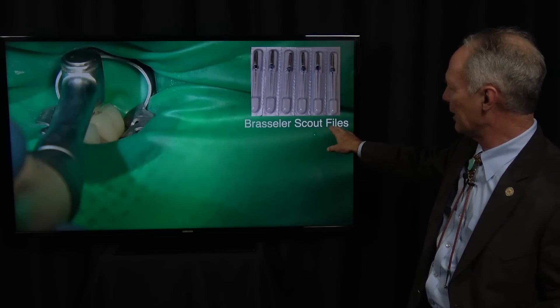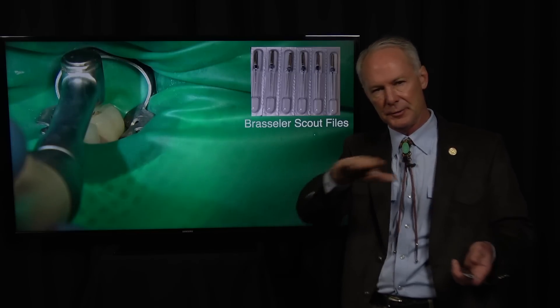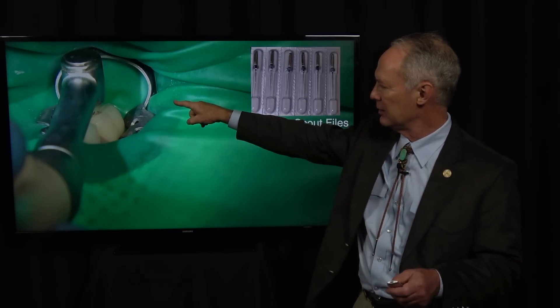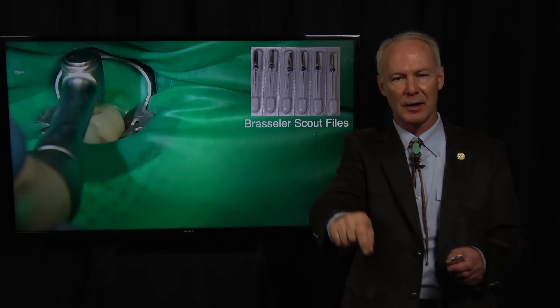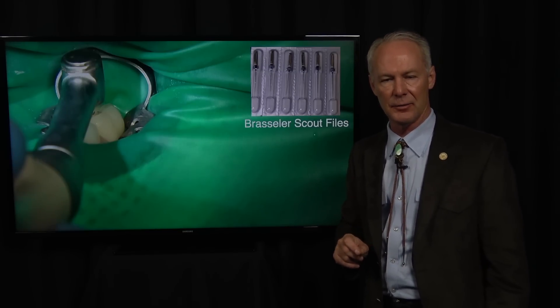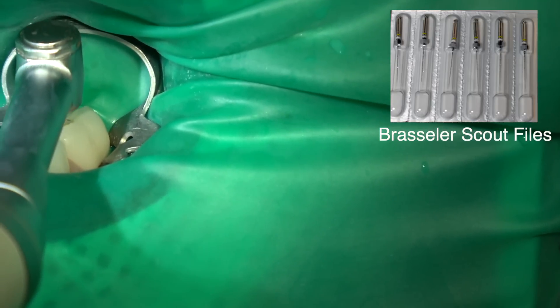These are Brasseler real-world endo Scout files — fantastic for locating canals. Some patients have sclerotic canals and you really have a hard time finding them. But once you've used your round bur and removed tooth structure where the canal should be, place your dilute sodium hypochlorite and put these Scout files on your rotary instrument and just poke around on the floor of the pulp chamber. You'll be surprised how often you just fall into that canal. These are excellent for finding hard-to-find canals like the MB2s, buccal canals on maxillary teeth, and mesial canals on mandibular molar teeth.